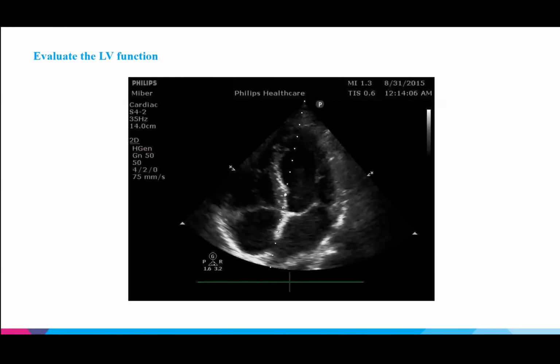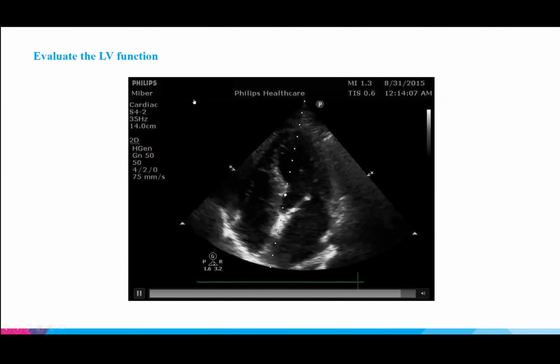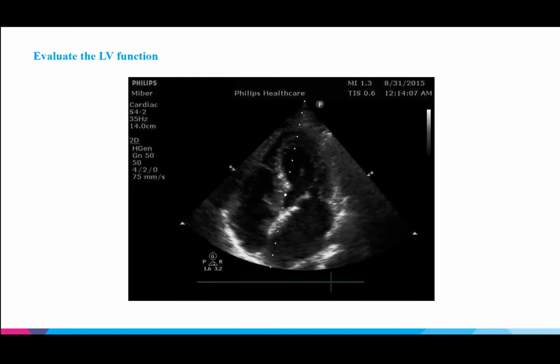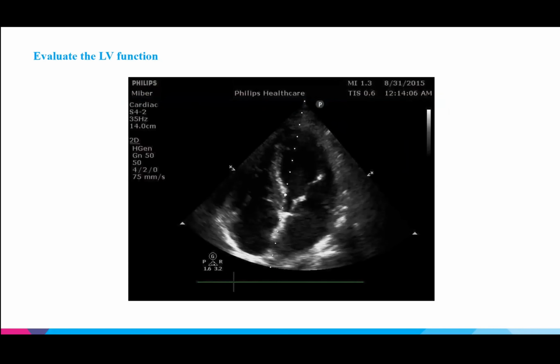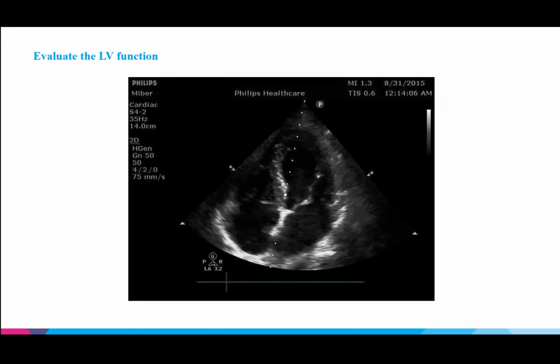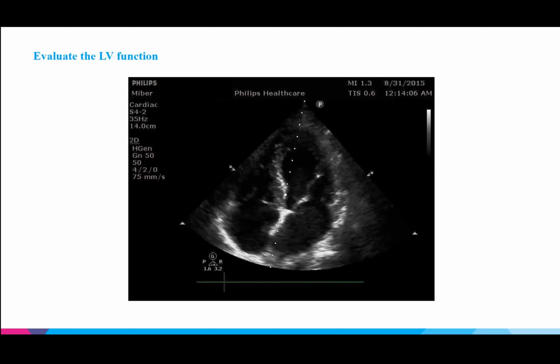All right. What about this one? Okay, so we're almost halfway. All right, so we have 66% with normal, 28% with reduced, and then a couple for hyperdynamic and severely reduced.